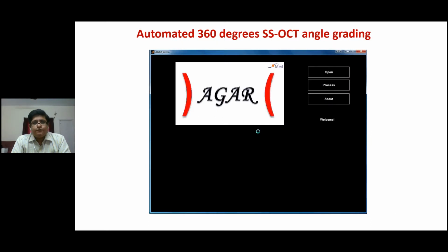Thus, we subsequently developed an automated method of detecting it. We have published a couple of papers, but the performance is not that similar to gonioscopy. That simply tells us that probably we are either underdiagnosing with gonioscopy or this device is overdiagnosing. The answer is yet to be found out.